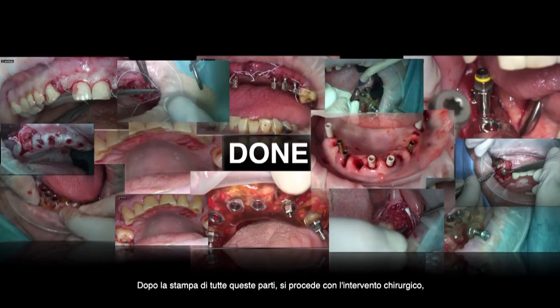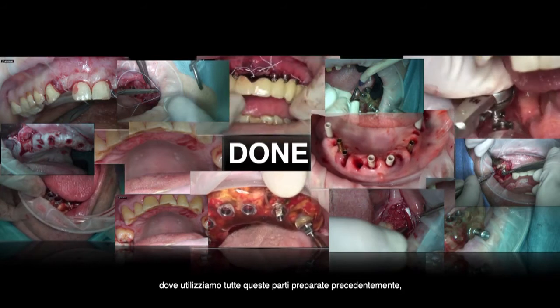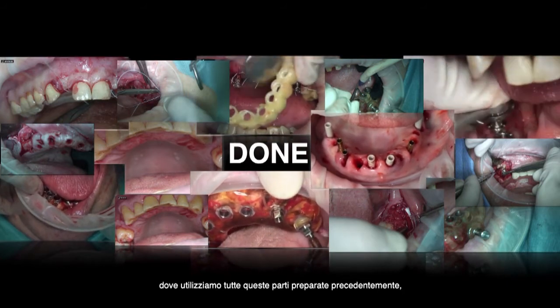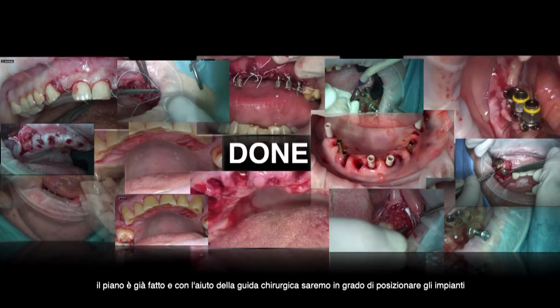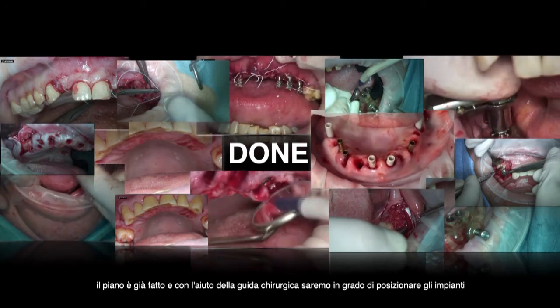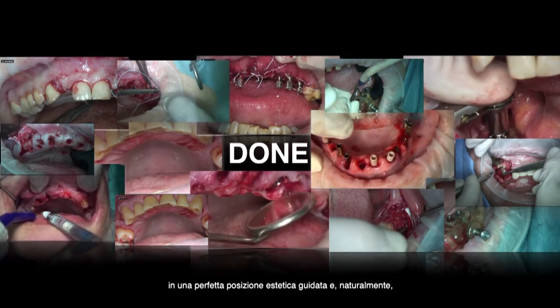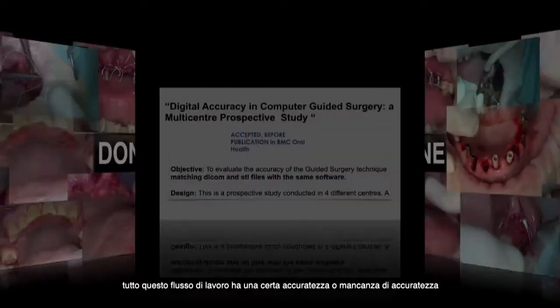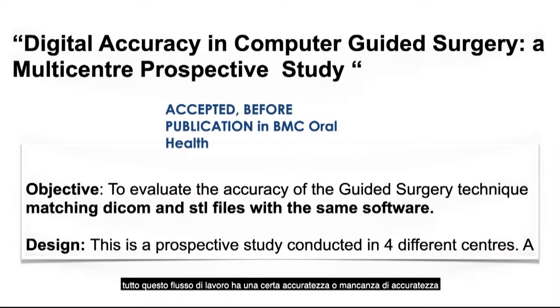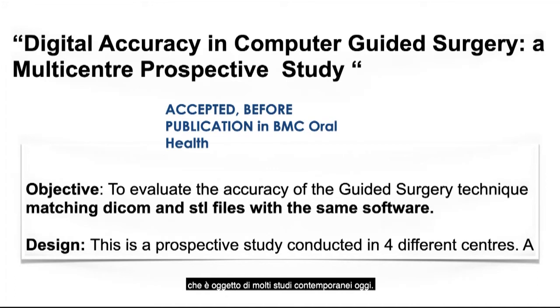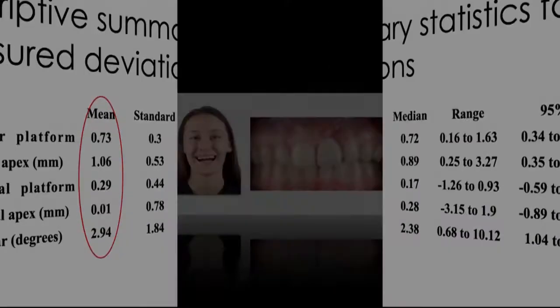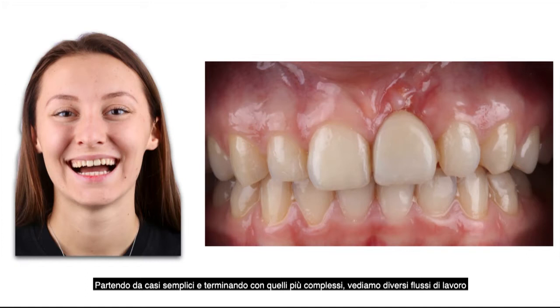After printing all parts, we proceed to surgery with all components pre-prepared and the plan already done. With the help of the static guide, we place the implant in a perfect aesthetically driven position. All these workflows have a certain accuracy or lack of accuracy, which is the subject of many current and ongoing studies, from simple cases to more complex ones.